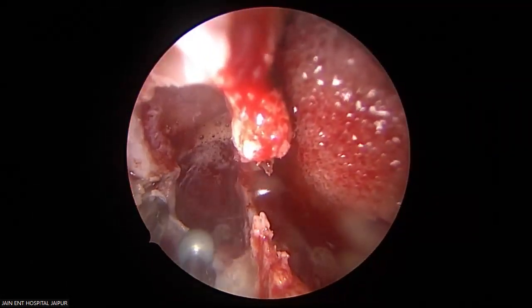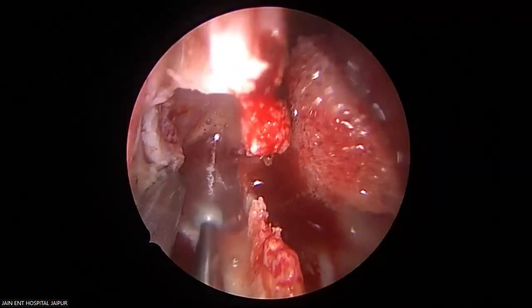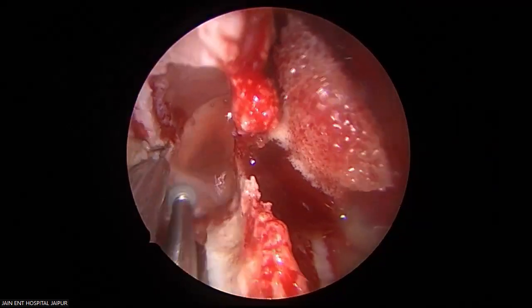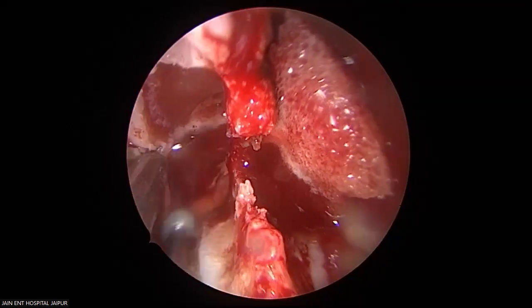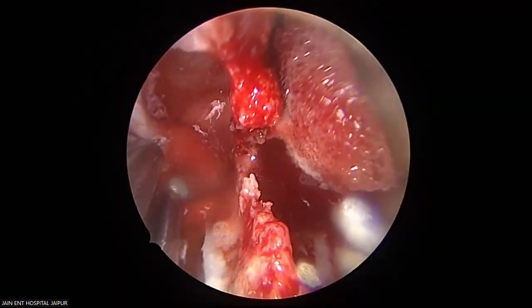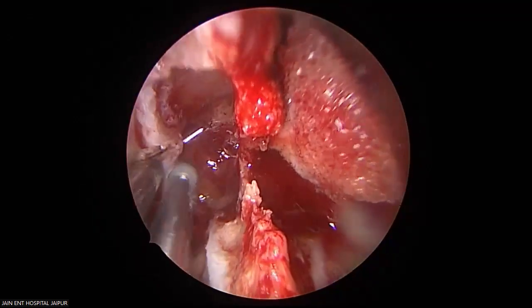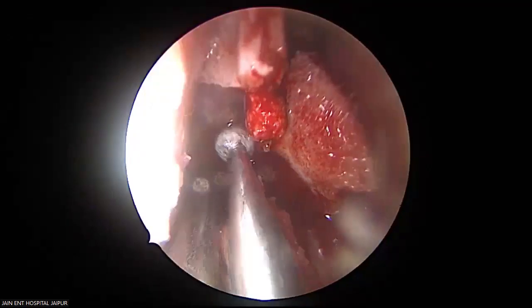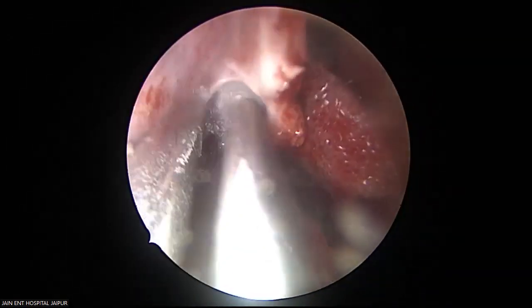That will be adequate for me, as I don't want to go lateral, as I will pull the tumor, whatever is going laterally, under vision. See the exposure toward the floor. This now toward the roof.